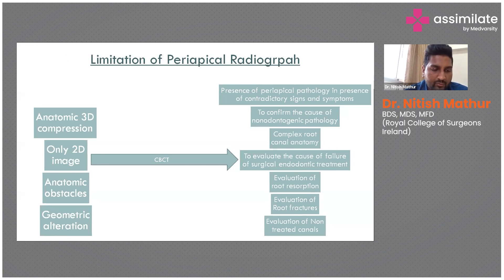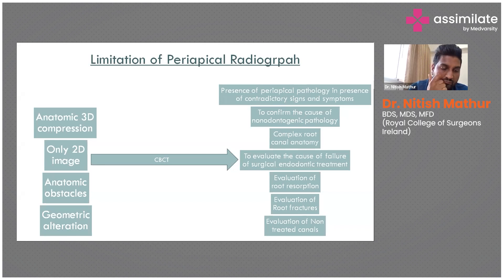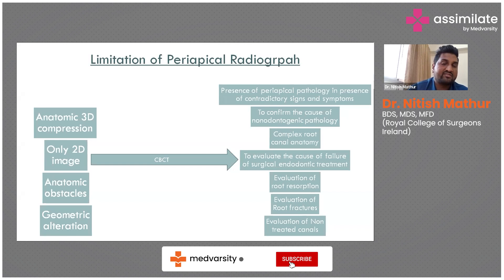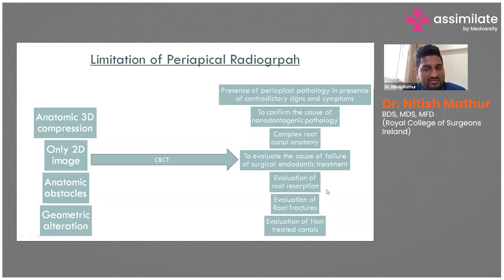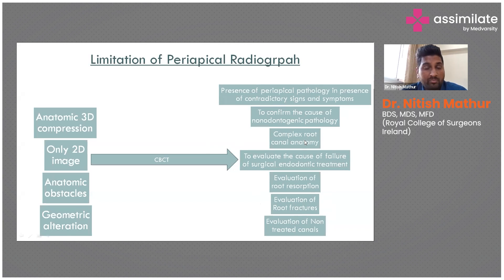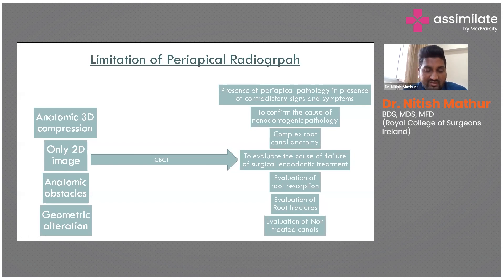Most of the time the periapical radiograph is sufficient, but in some scenarios a higher imaging modality like CBCT is considered. The European Society of Endodontology suggests CBCT use for: evaluation of untreated canals, root fractures, resorption, failure of surgical endodontics, complex root canal anatomy, confirmation of non-odontogenic pathology, or periapical pathology with contradictory signs and symptoms. Otherwise, we can rely solely on periapical radiographs.